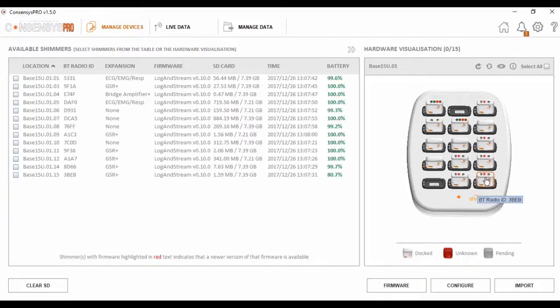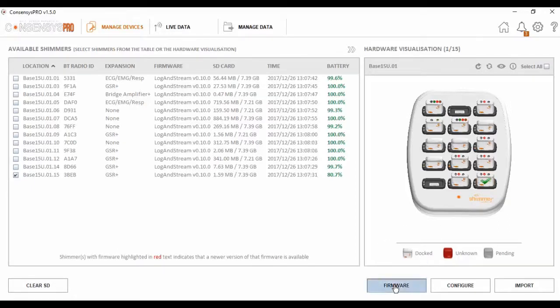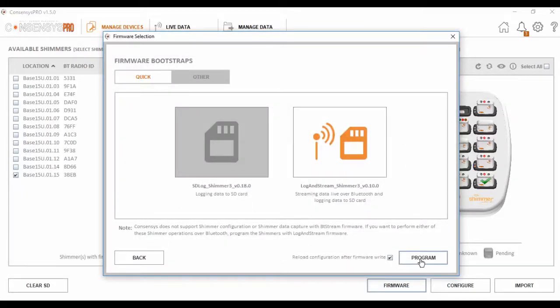The first step in the data collection process is to ensure the firmware is set correctly. I select the unit I want to collect data from, and then click the firmware here. And the firmware I want to use today is Login Stream, so I simply select this and write to the unit.